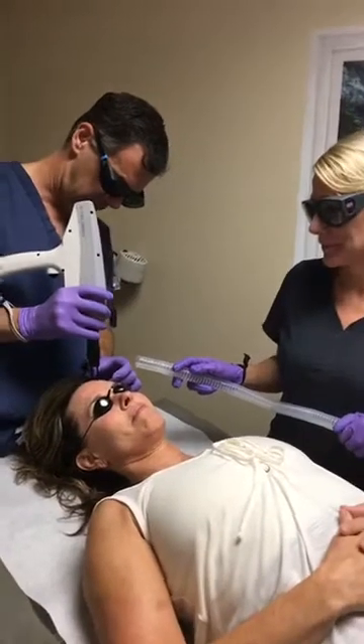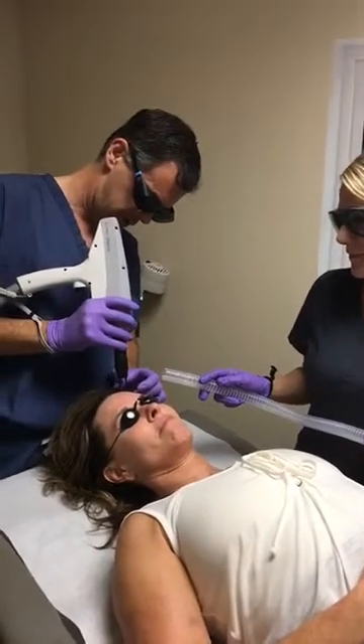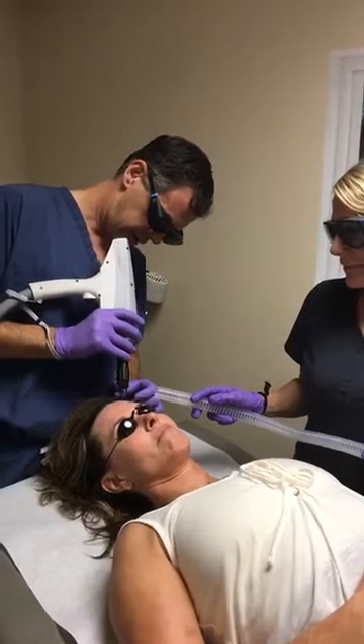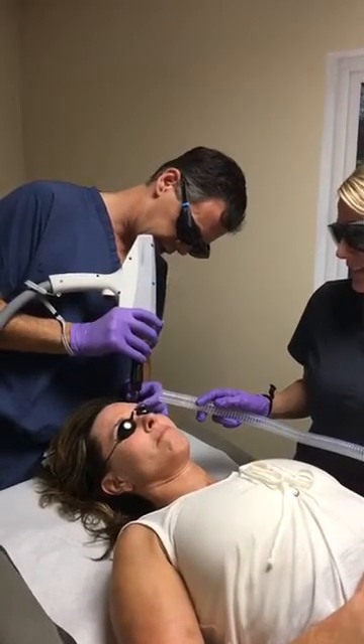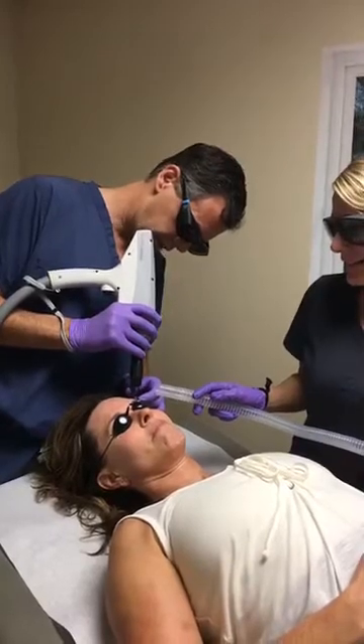We put a numbing cream on Tracy about 45 minutes ago. This is a nice result that we are getting. We are taking layers out of her skin.